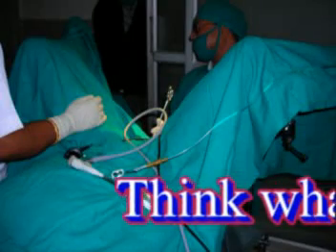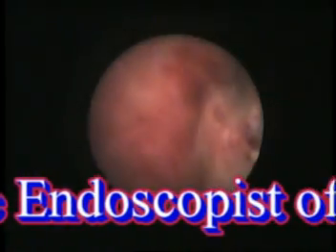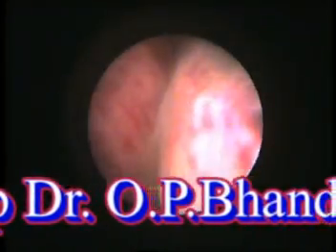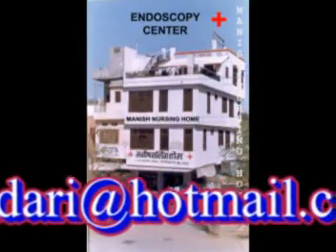This is the scene of an operation theatre at Manish Nursing Home. The procedure going on is hysteroscopy — that is, looking into the uterus. It is a really interesting case we are seeing in the cavity of the uterus.